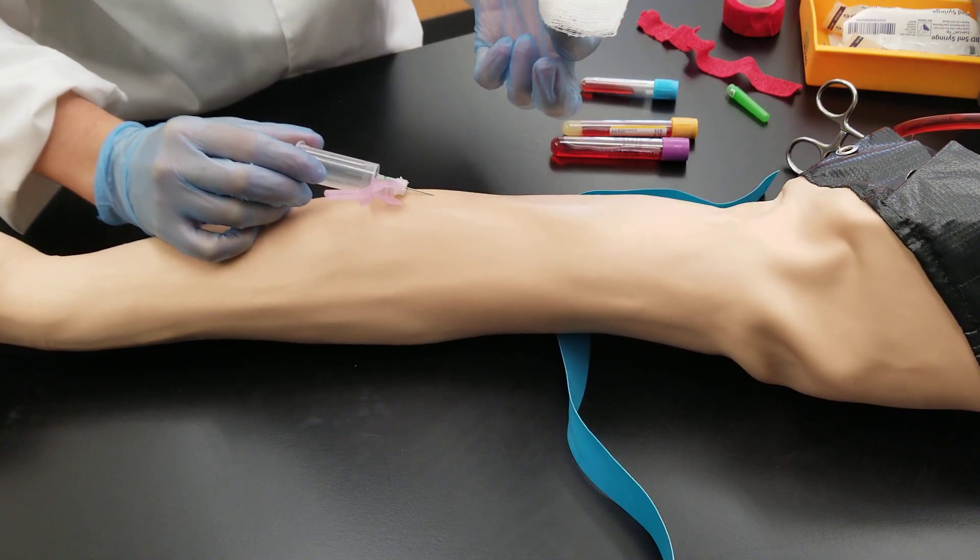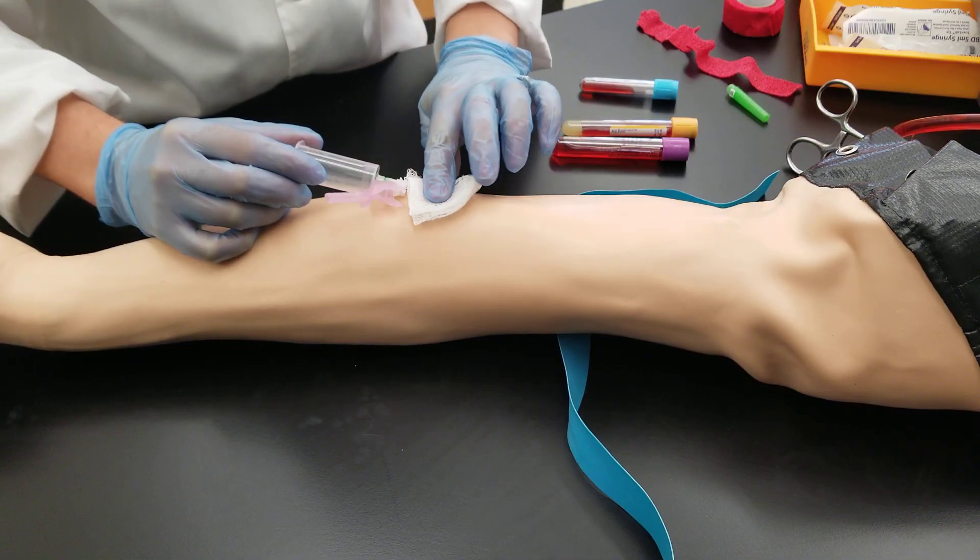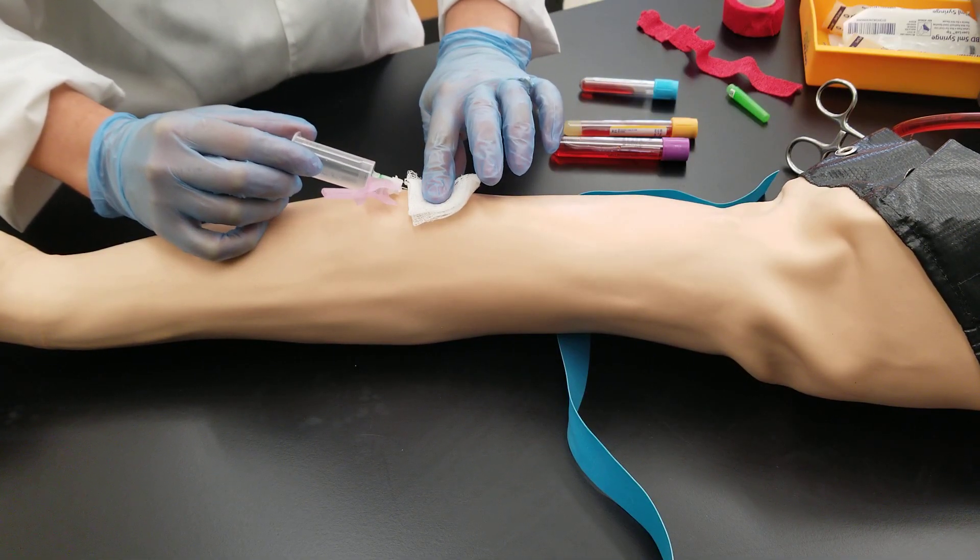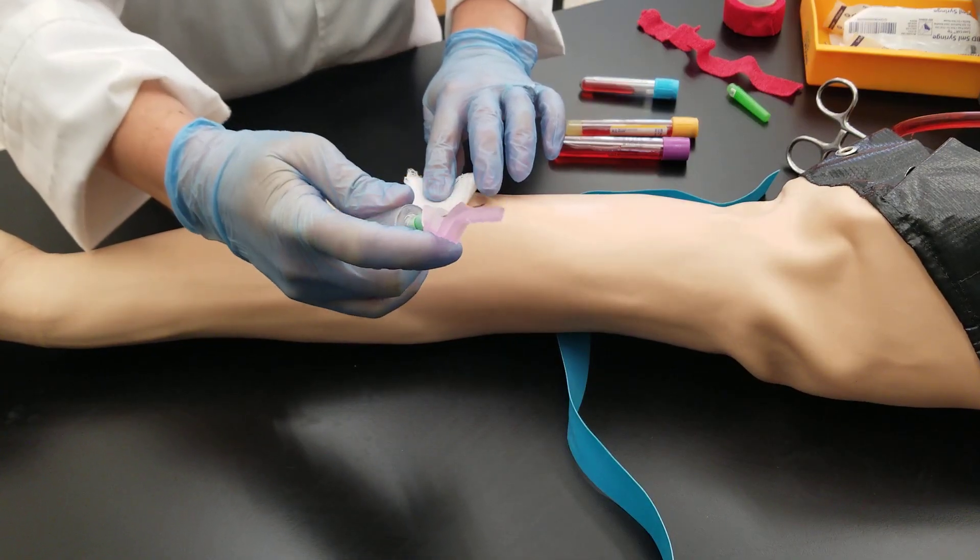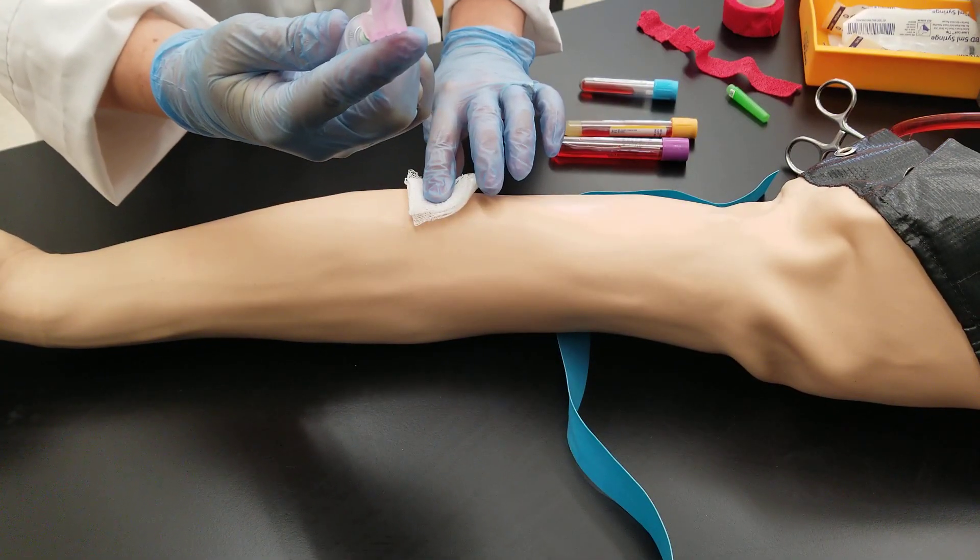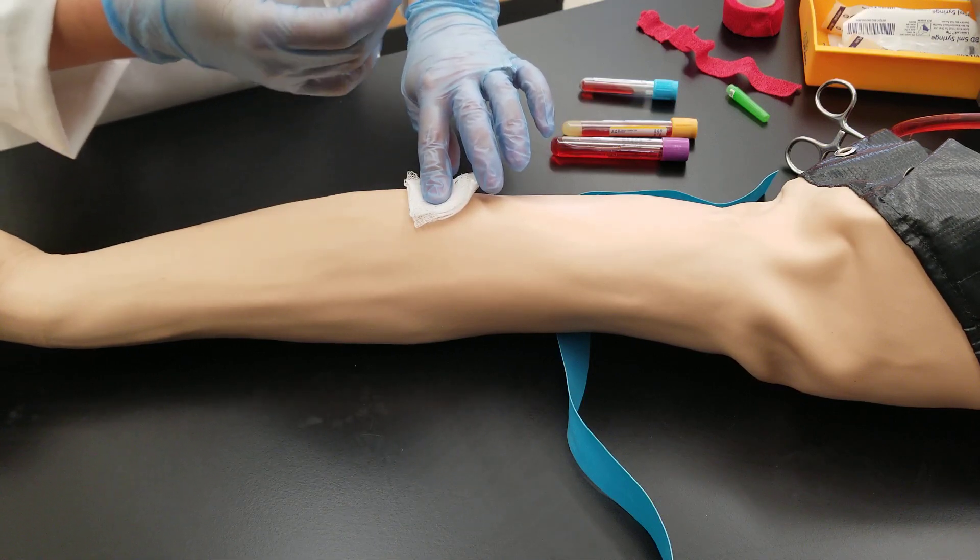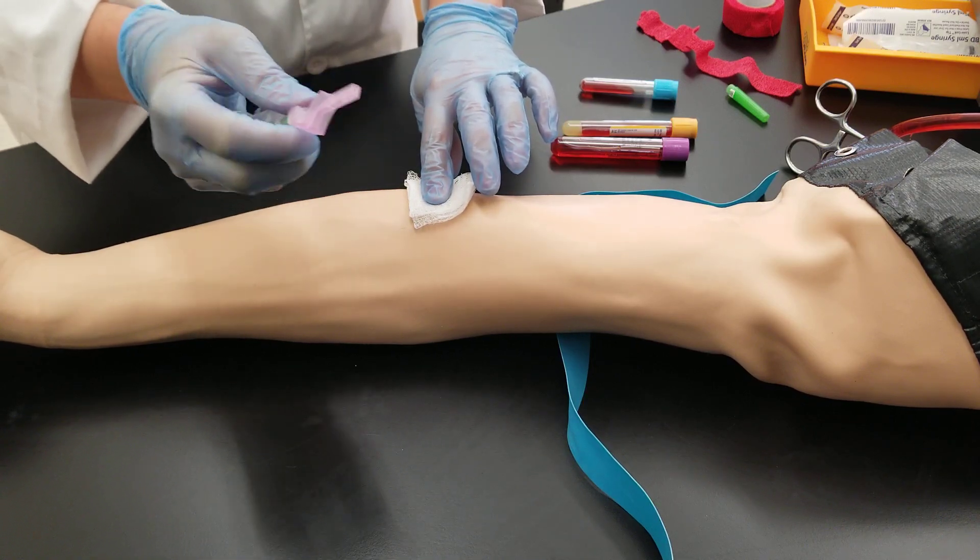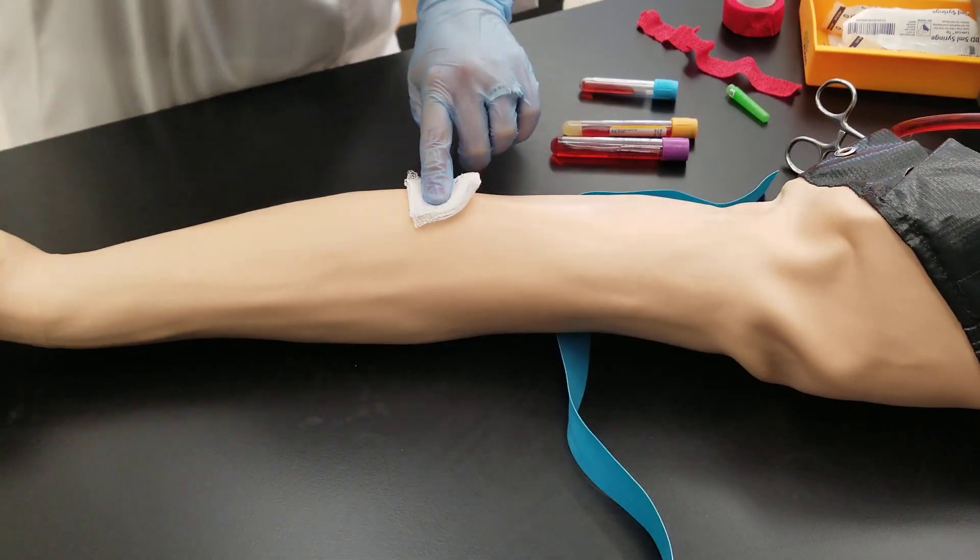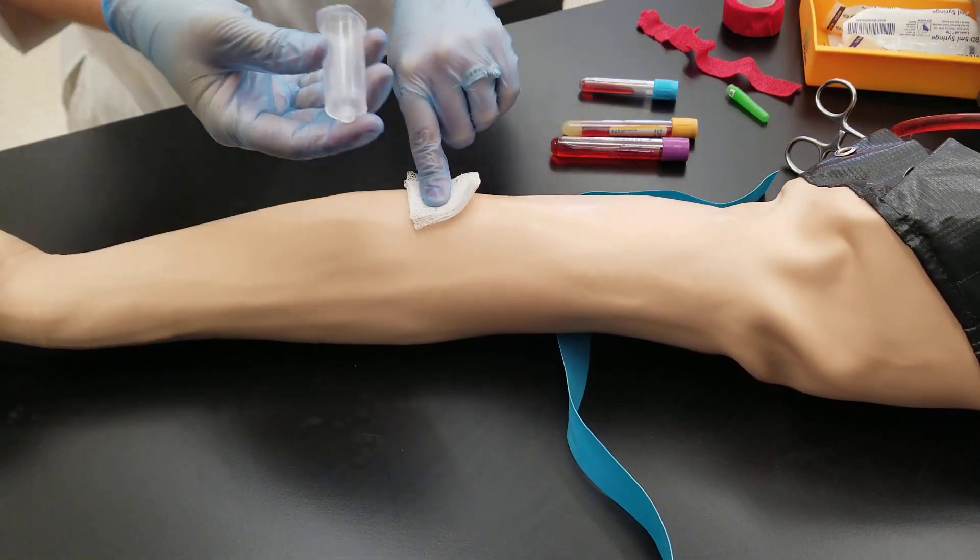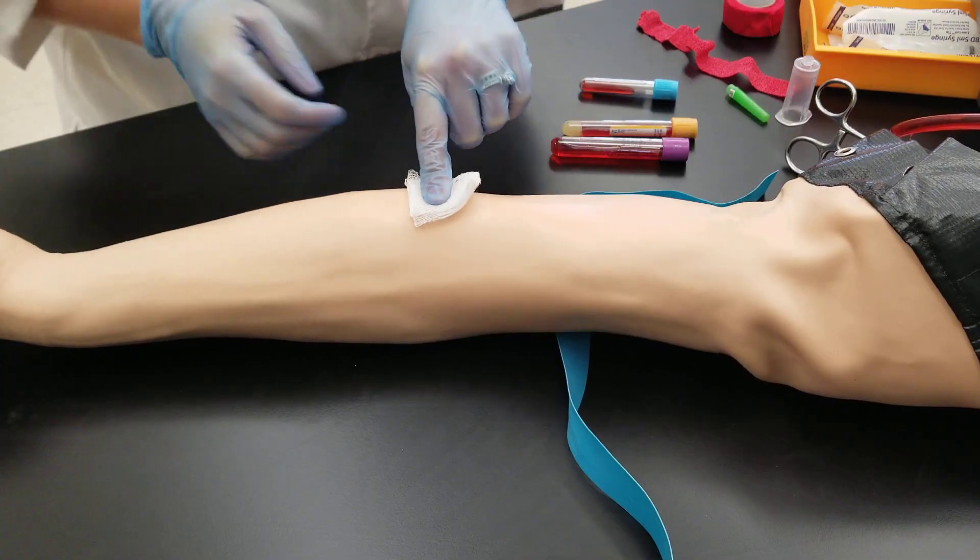Have my gauze that I'm going to place over the spot where I drew and I'm gently pulling the needle out. Flip the safety over using your finger, your forefinger. I'm going to remove the hub and put the needle into the sharps container. This will go in the regular trash.